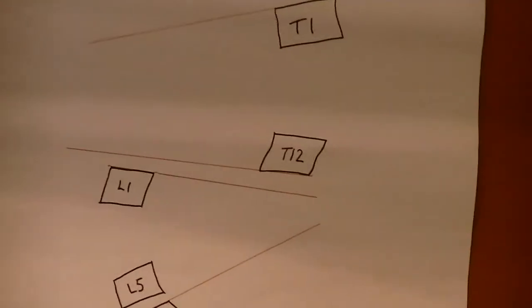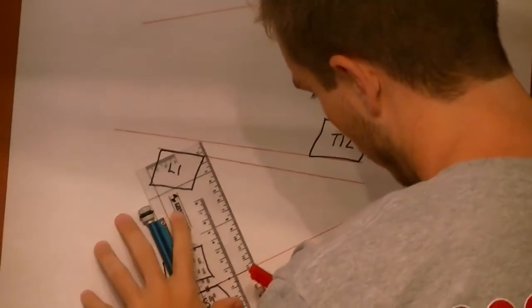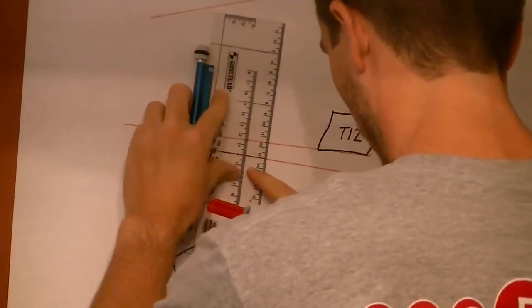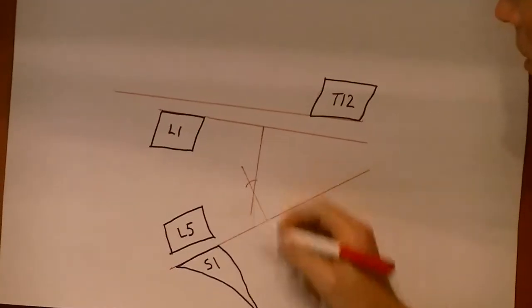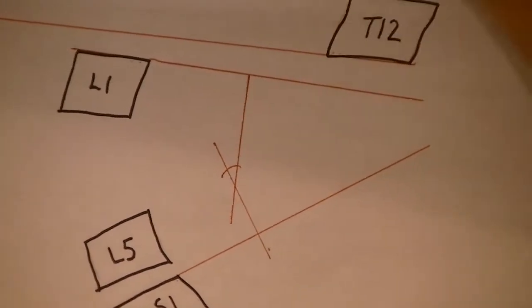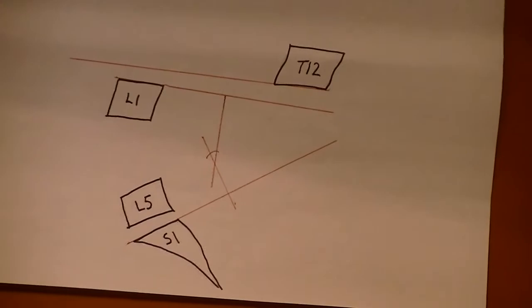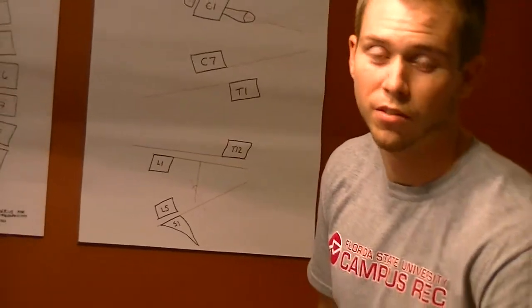Alright, and now with this you're going to make perpendicular lines, you're going to draw them out, and you're going to measure where they intersect. So right here, this is where you'd measure. And for the interest of time, you do the same thing for all of these other ones: you draw a perpendicular line out. So you draw a line up here, and then here, and wherever they cross, that's the angle that they make. And then you'll be able to figure out what their degree of kyphosis or lordosis happens to be. And that's pretty much everything we covered in lab.